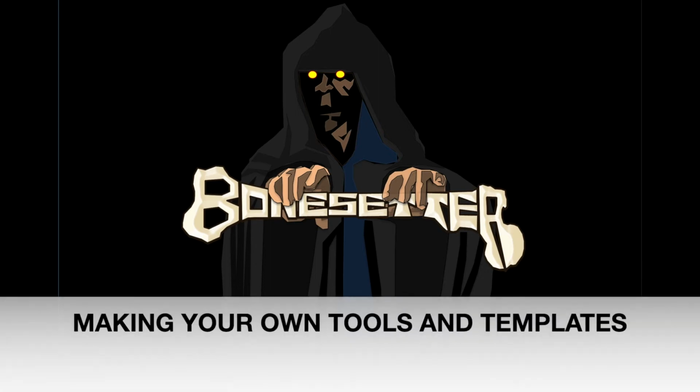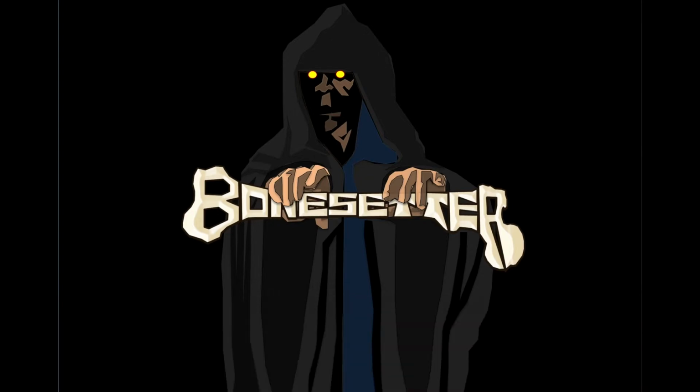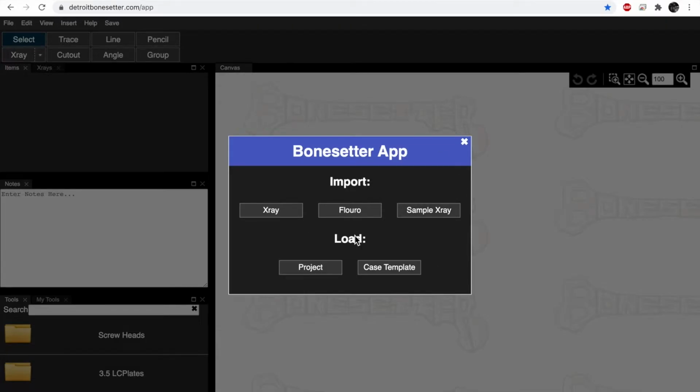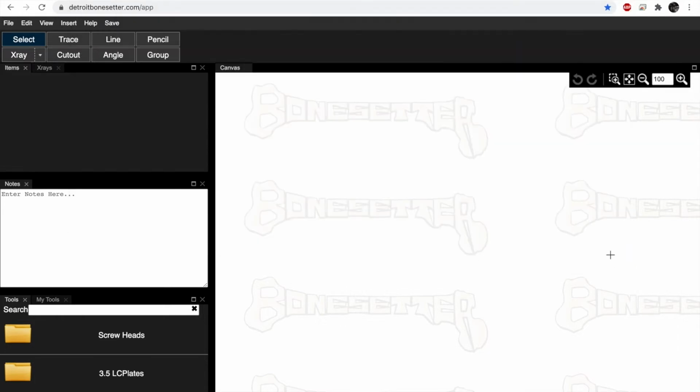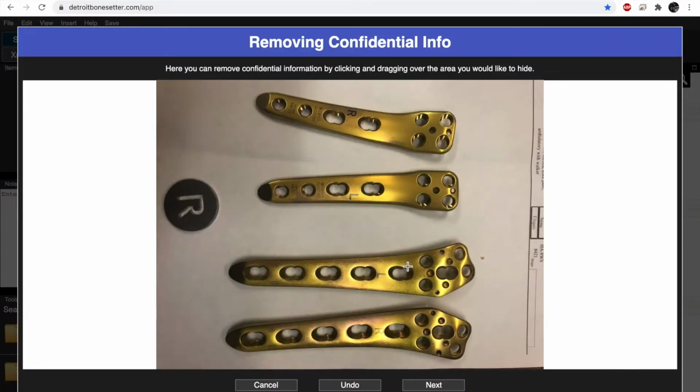We're going to show you how to make your own tools and your own templates. If there's a tool, like an implant, that's not in Bonesetter, I'm going to show you how to make your own. So we've signed into Bonesetter, and I'm going to call for an x-ray, and I'm going to pick a picture that I took of some implants. Here are the implants. And I took them next to a sizer. This is a 3 centimeter sizer.